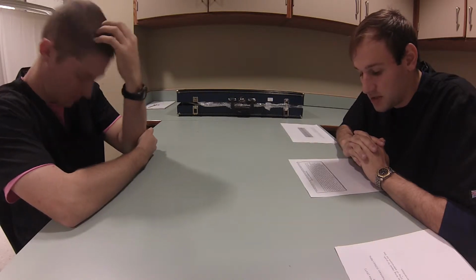You will first need to verbally inform me of your interpretation of the rhythm and condition. Then you must tell me all the treatments and interventions you would provide to this patient in the field. Assume that the rhythms you see in the 6-second strip continue in each patient and do not change. You may pass on any card and come back to it at any time. You will have a total of 6 minutes to complete all 4 of the patient encounters. Do you have any questions? No.